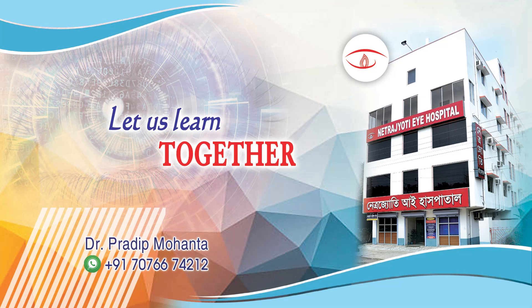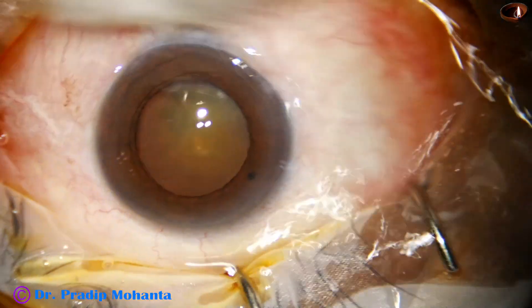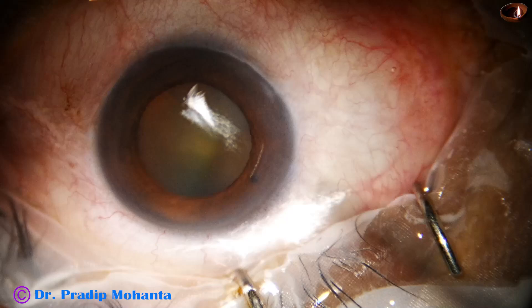Dear colleagues, in this video we will see pre-chop of a cataract with mid-dilated pupil. This is a real-time, totally unedited surgery.